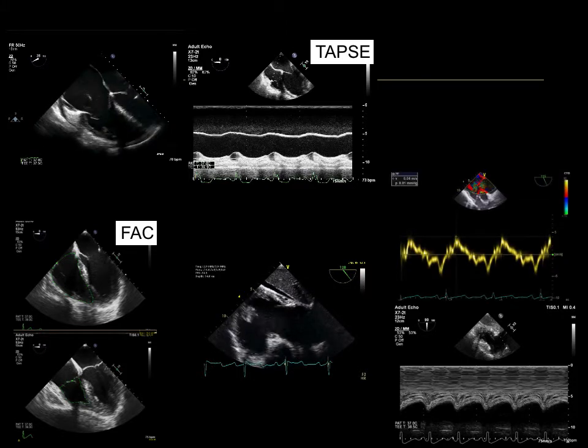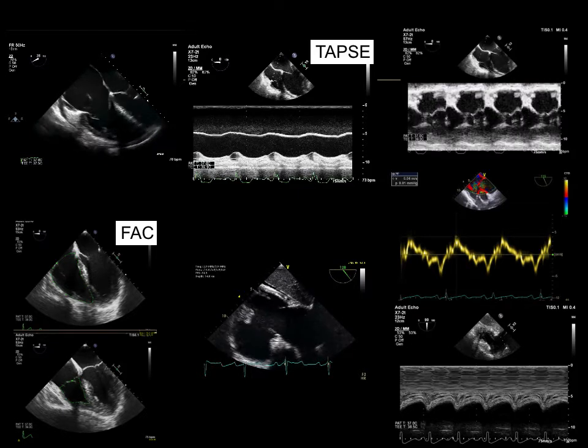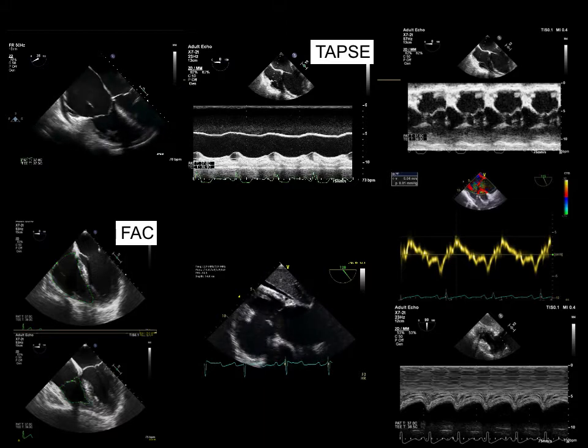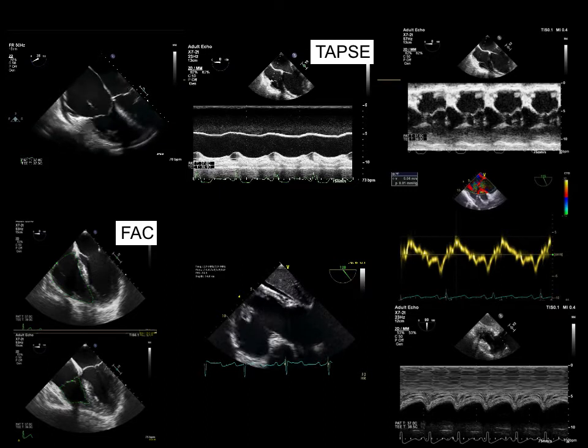in transthoracic. We can also use tissue Doppler and measure the velocity of displacement of the myocardium at the level of the tricuspid valve. Or some of the newer machines allow us to use anatomical M mode, which is a technique that uses a computer algorithm where we can put our M mode line wherever we want. So in this case, we can take this M mode line from here and flip it around, like we've done here. We flip it around and we align it where we think the movement of the tricuspid annulus would be. And so we have a displacement here, which is closer to what we get with transthoracic echo.